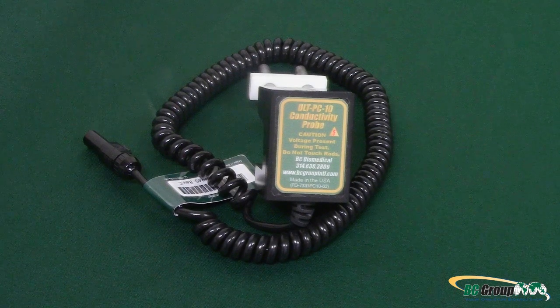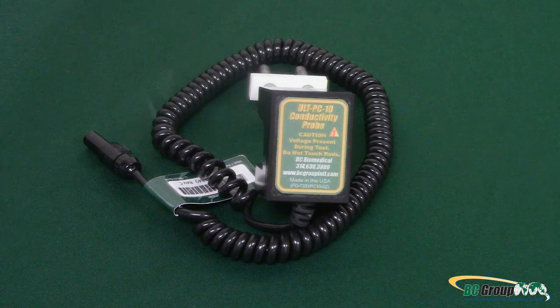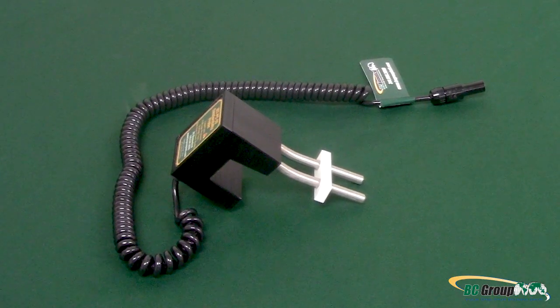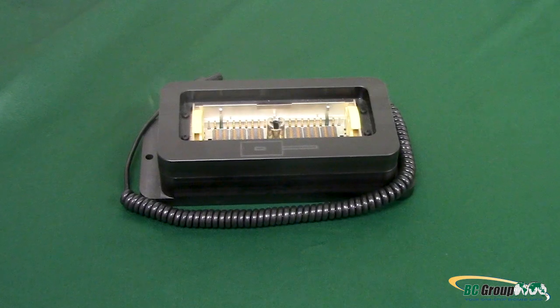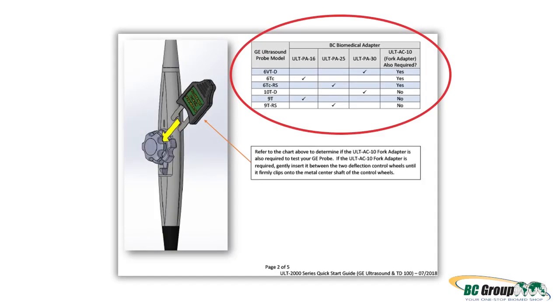ULT PC10 for soak tray, the ULT PC30 for soak tube, or the ULT PC31 for the TD100. For this demonstration, we will be using the ULT PC10 Dual Conductivity Probe. You will also need an appropriate GE transducer adapter. Refer to this chart in the Quick Start Guide to determine what model adapter you need, as well as if your GE probe requires the fork adapter.